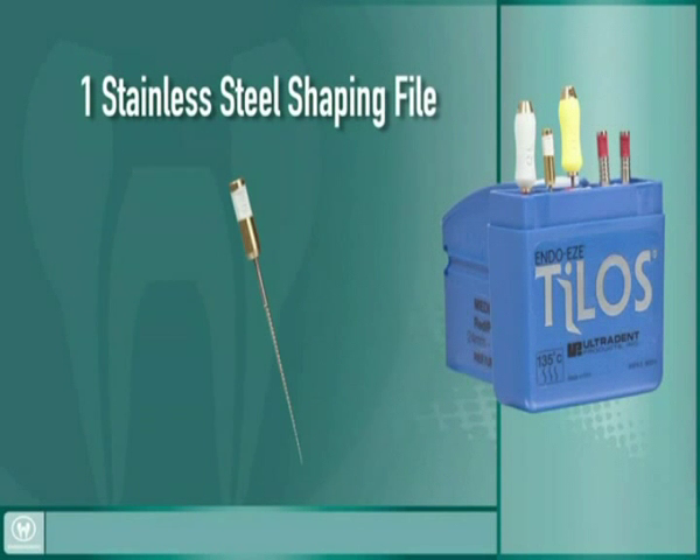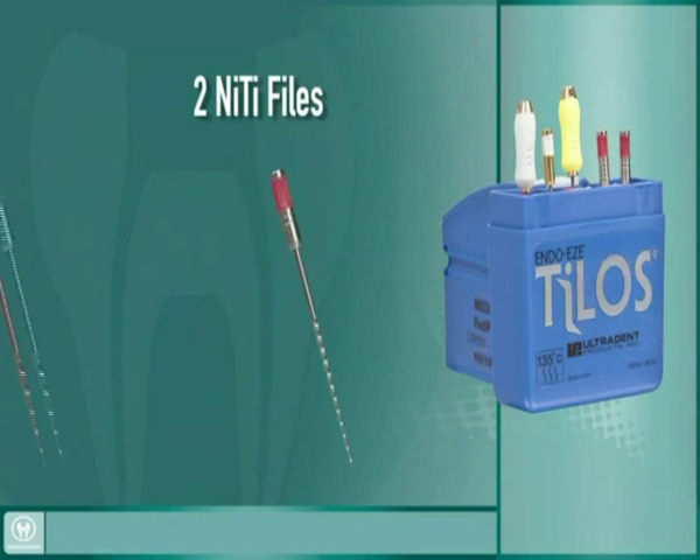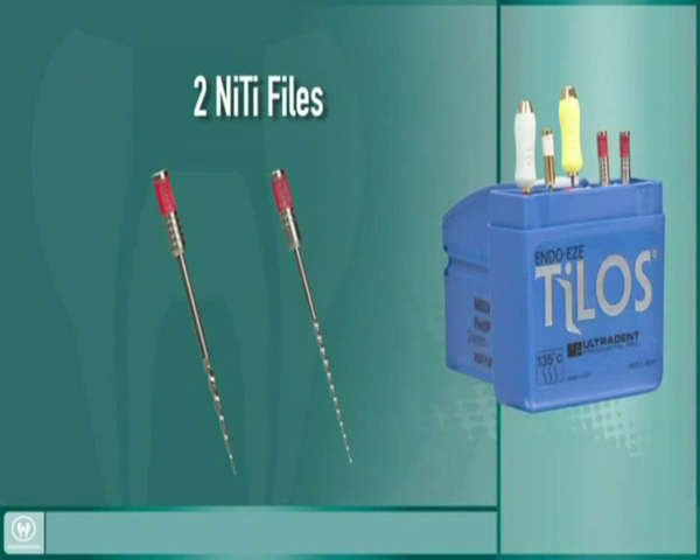One stainless steel shaping file for cleaning the middle third of the canal to remove interferences and finalize a good glide path, and two nickel-titanium files for transitioning through the apical third of the canal.